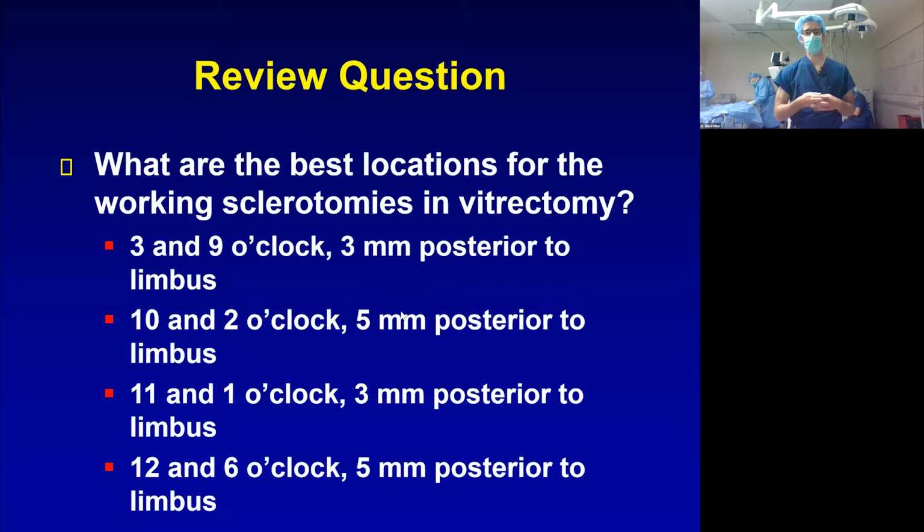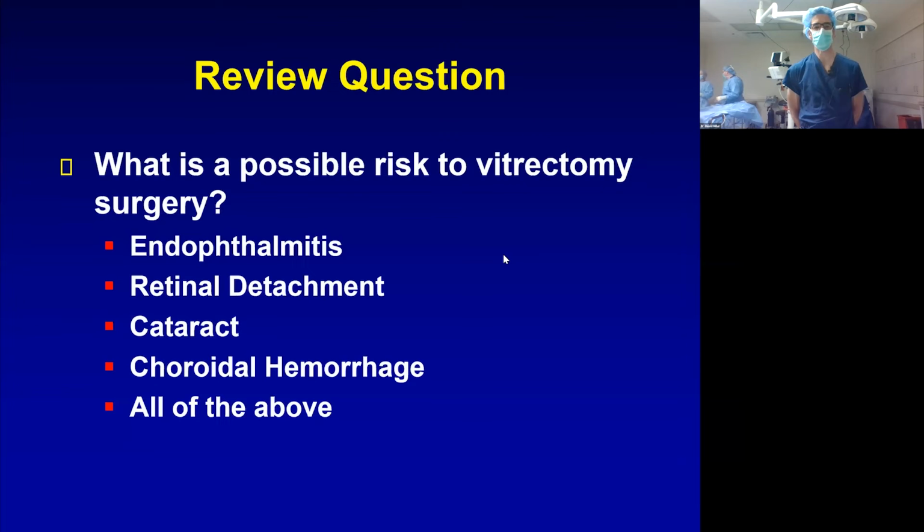3 and 9 o'clock, 3 millimeters posterior to the limbus. 10 and 2 o'clock, 5 millimeters posterior to the limbus. 11 and 1 o'clock, 3 millimeters posterior to the limbus. And 12 and 6 o'clock, 5 millimeters posterior to the limbus. The polling results. We'll go on to the next question. I'll review these again at the end of the talk, at the end of the surgery.